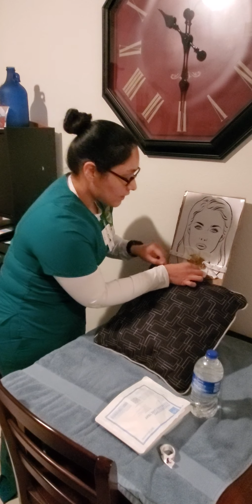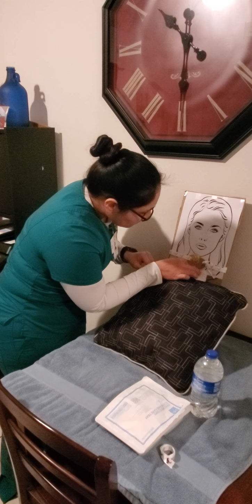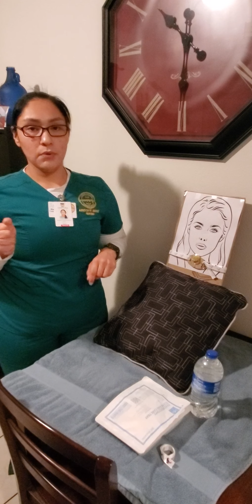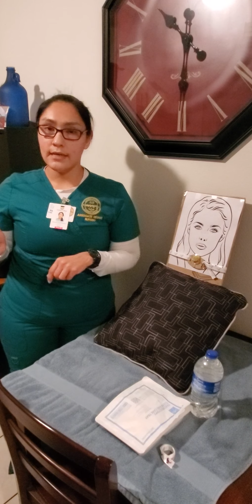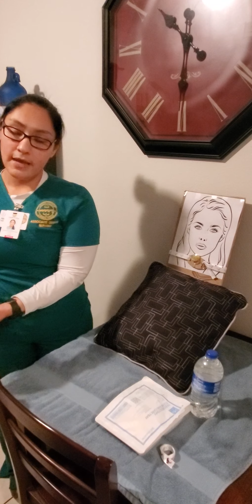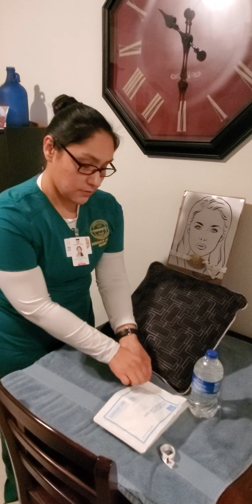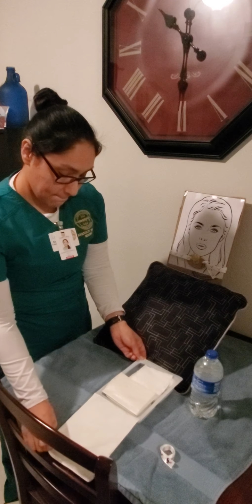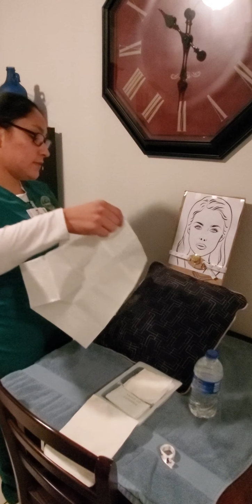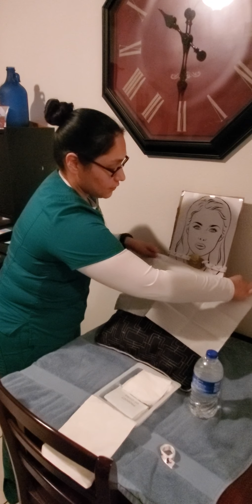So we're going to go ahead and do that. Okay, and we go ahead and dispose of the old dressing as well as the gloves. Okay, so we perform hand hygiene again, and I'm going to proceed to opening the package. First I'm going to start off by draping the patient, and this is just to avoid getting any secretions on your patient's gown.